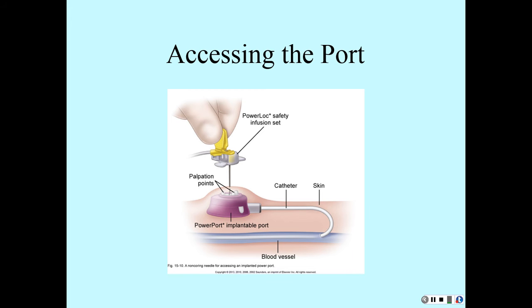And that, again, depends on your protocol. But we don't access these every 8 hours to flush them. You can access it, leave it accessed, and then flush it that way. But once you access it, you leave it accessed until you're finished.